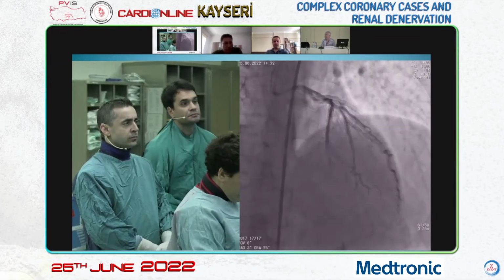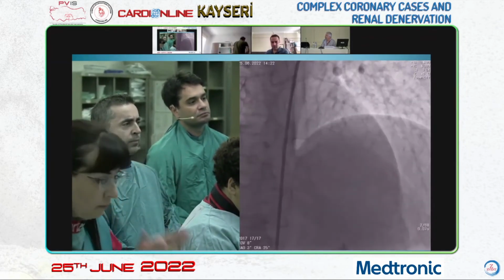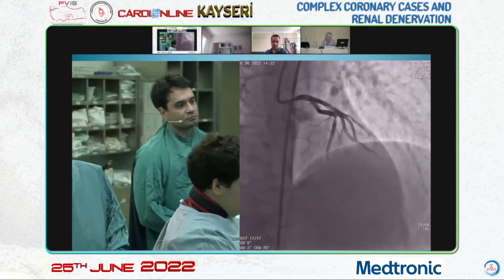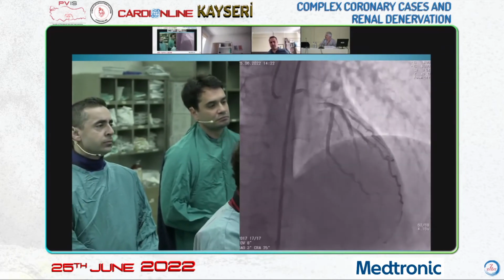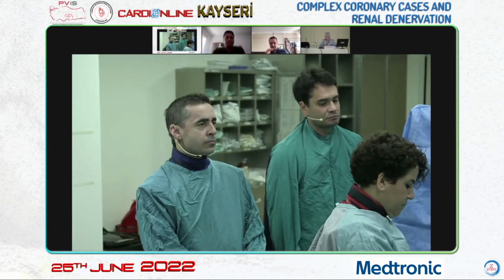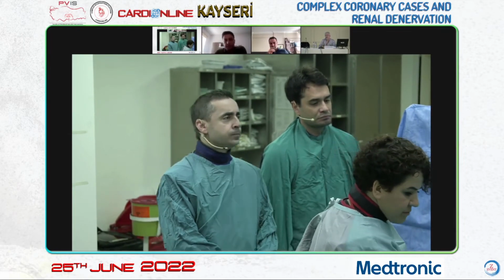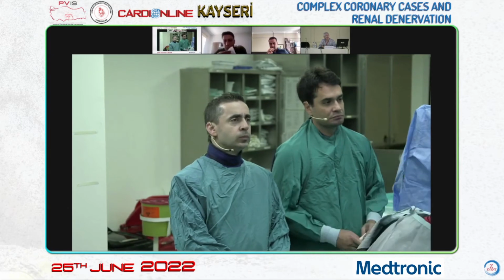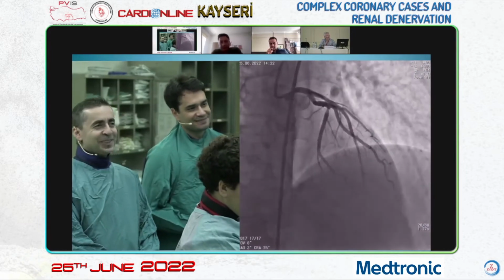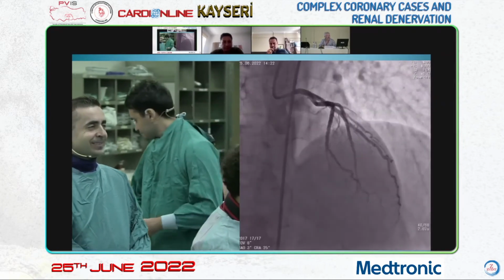I'd like to make another comment. In the circumflex, can you see the collateral to the apical? It's the reason why we see the hypoperfusion. So the collateral flow is about physiology, and the tissue will repair itself. It's about the retrograde flow and the club is there. So you can see this, and it's not a bad idea. So we can just leave it there.